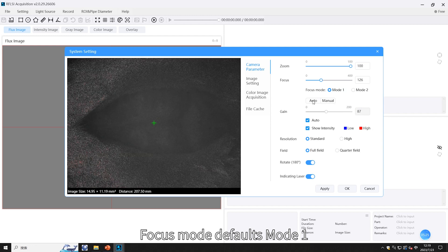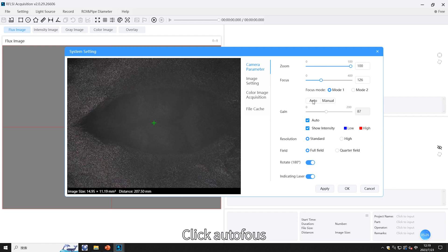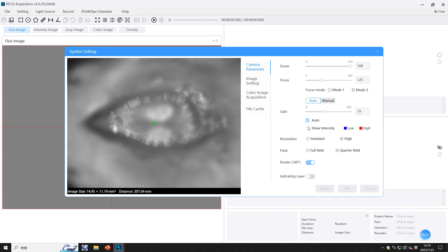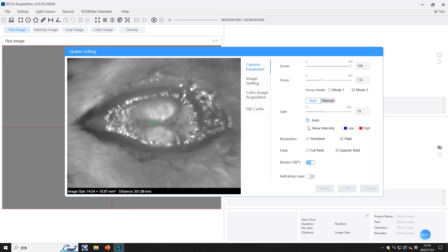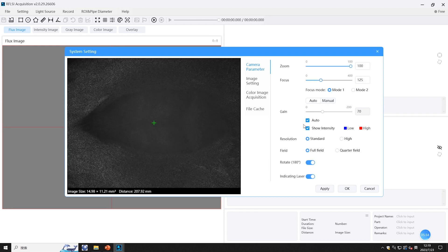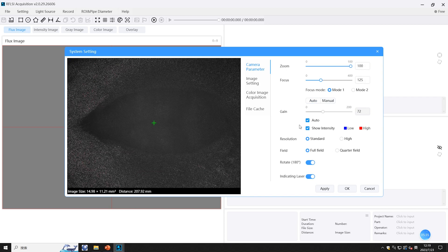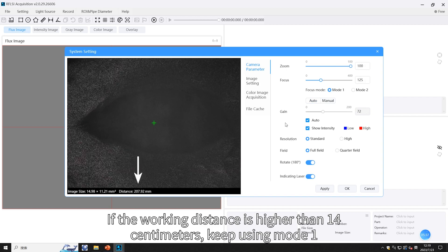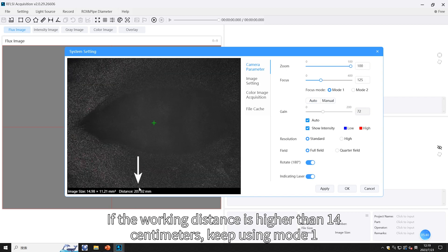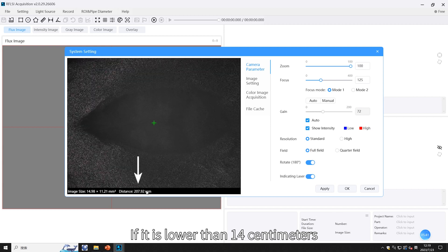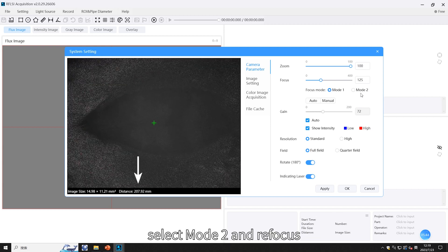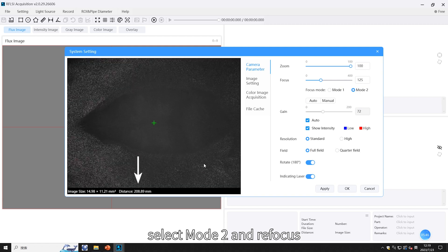For focus mode, the default is Mode 1. Click auto focus. If the working distance is higher than 14 centimeters, keep using Mode 1. If it is lower than 14 centimeters, select Mode 2 and refocus.